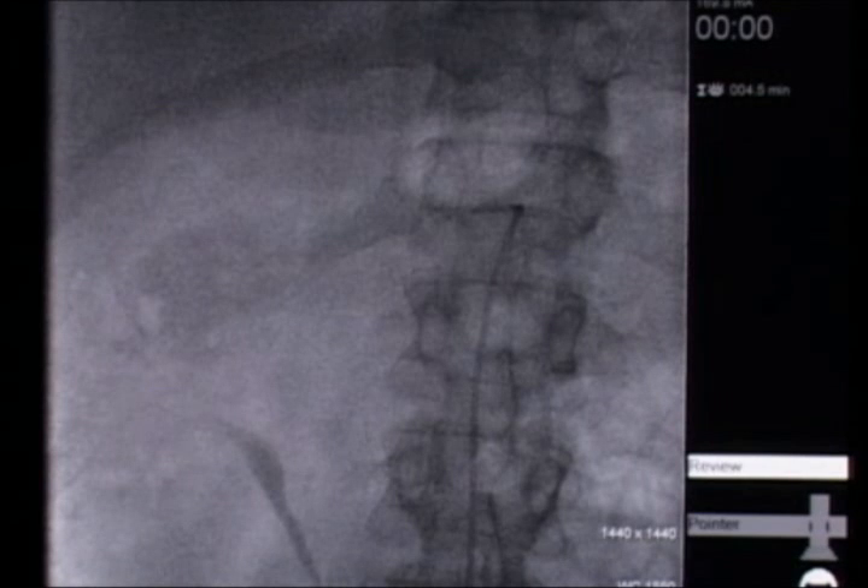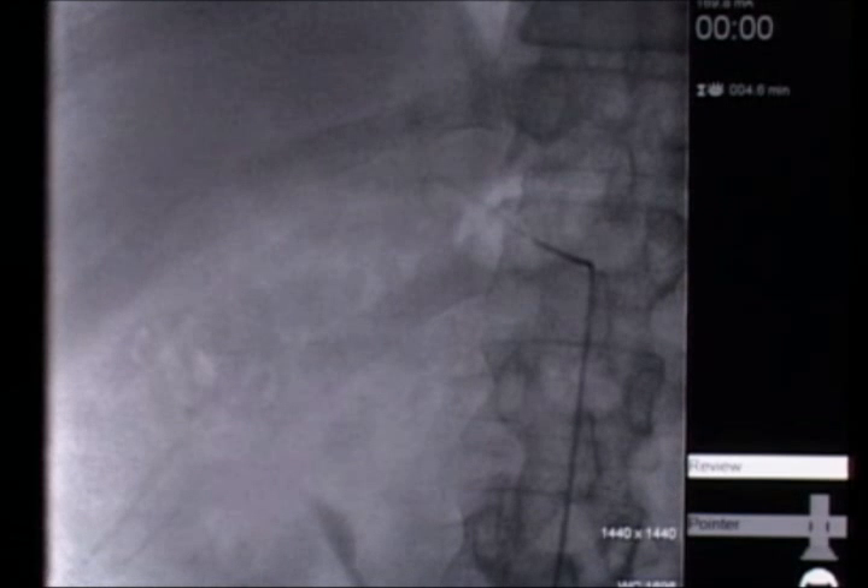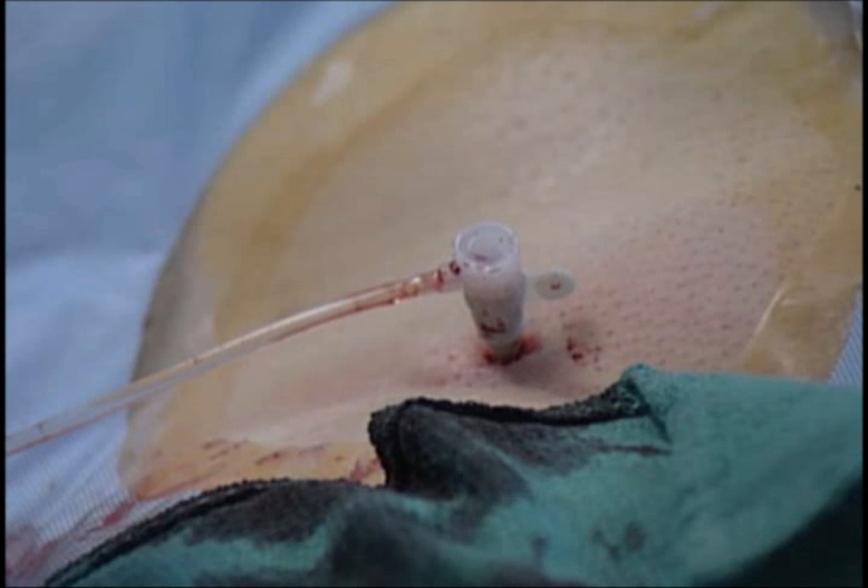This is footage from the procedure, showing the contrast going in. I want you to pay attention to a still shot coming up very shortly that will show a lot of black or gray density at the top of the liver — that is after we're done treating. The next shot of the liver will show the smaller amount of material that was present before we treated today. The stuff being put in now is the chemoemulsion mixture, coming into that vessel and gradually building up in the area of tumor to end with that darker gray appearance you saw in that still shot just a few moments ago.